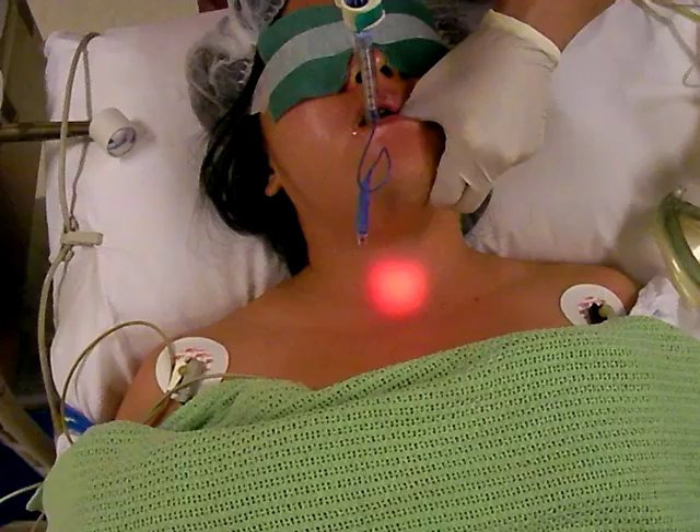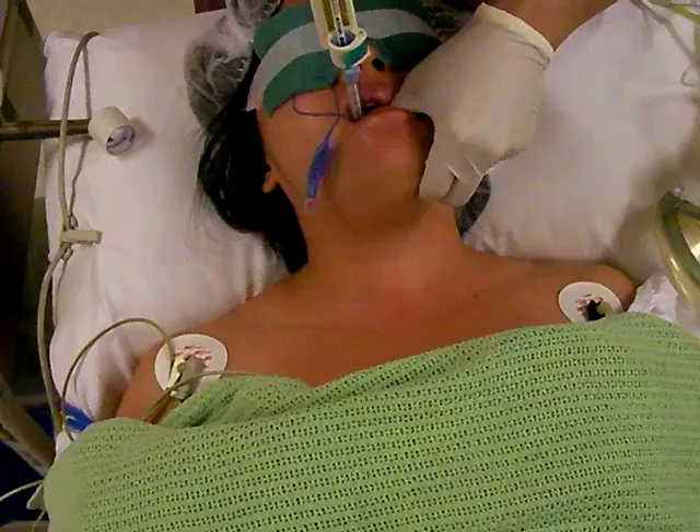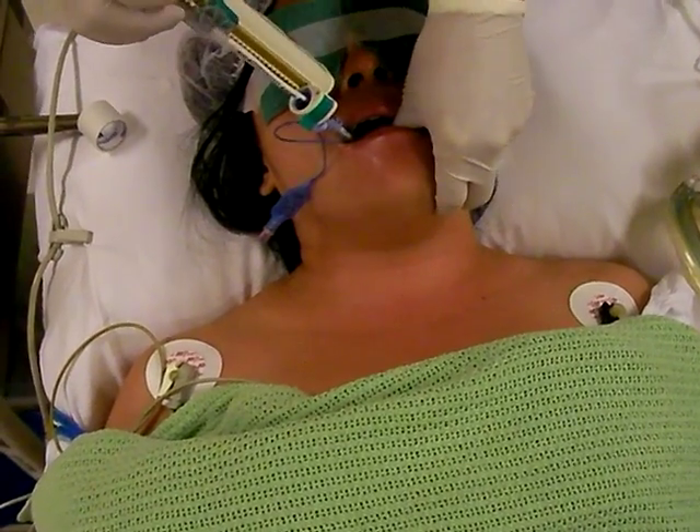You now retract the stiff but retractable stylet by 10 cm. And then you put the whole thing in until the desired length.